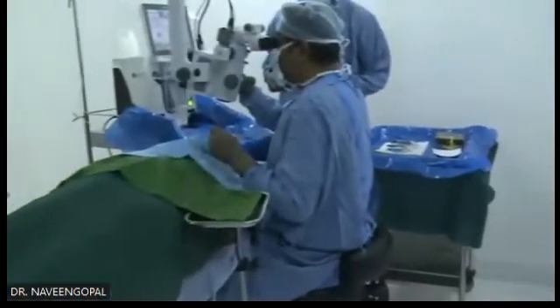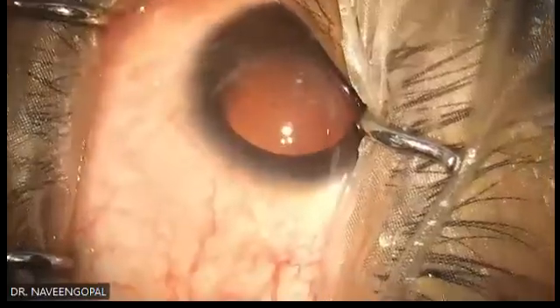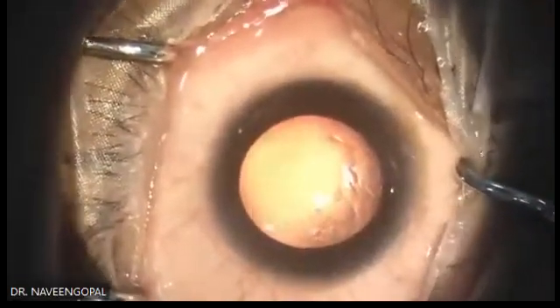I have a coaxial. This is coaxial. The glow will be very nice. See, he can't tolerate the light so much. That's why I do it in coaxial. This is very tolerable for him. This is very low illumination. All these small things matter.